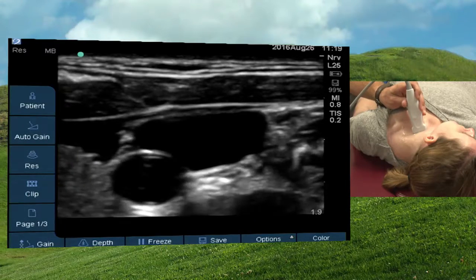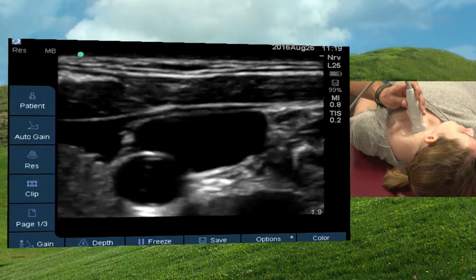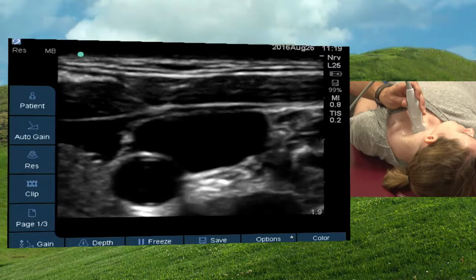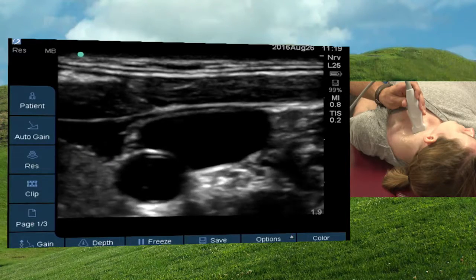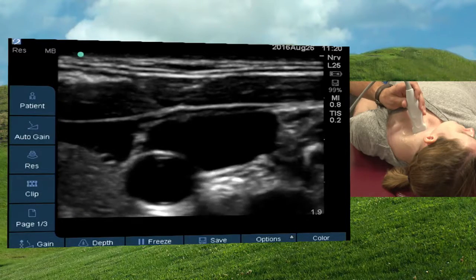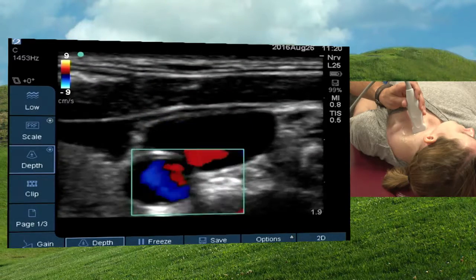Putting in central lines is a lot of fun, and some of you are probably doing it out there as fourth years, but there are some severe complications that can occur. And one thing that's very, very important to note and be able to do is to tell the internal jugular vein apart from the carotid. And it's pretty easy here on Beth, because we can see a briskly pulsating carotid artery.